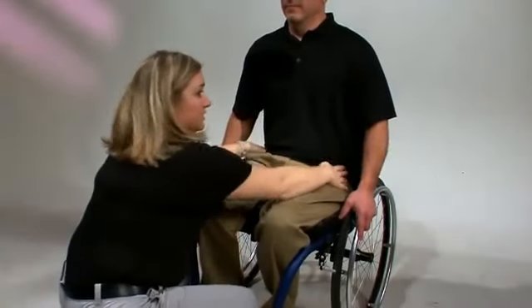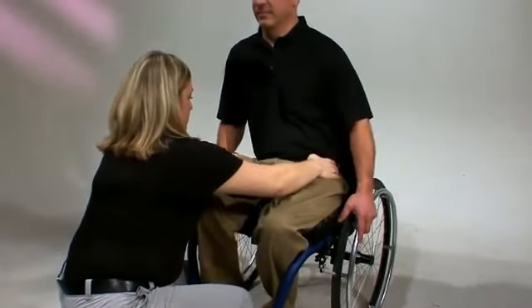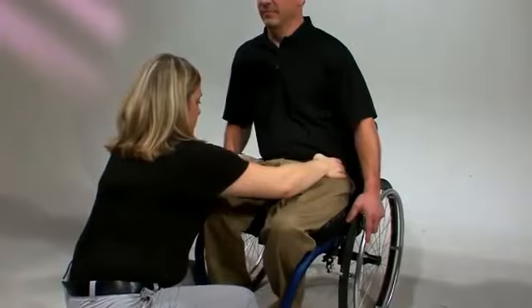Rojo recommends doing a hand check daily to ensure the cushion is properly inflated. If the suggested distance has changed and there is more or less air in the cushion, make adjustments as just demonstrated. Now let's talk about how to position someone with a flexible pelvic deformity while using the isoflow memory control.